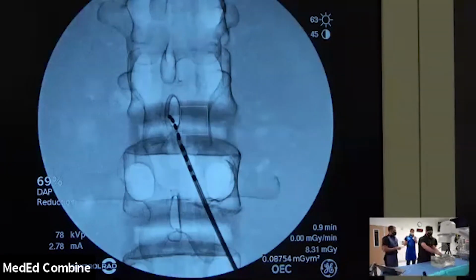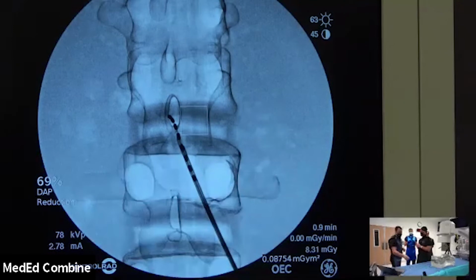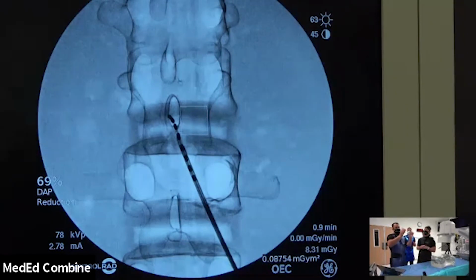Yeah, so it is an anatomical placement. Between T8 through T10 is where we're going to place leads. We're going to stack them. And the nice thing about these leads, we were talking about the StimWave leads earlier, but once again, big leads give you a lot of area.